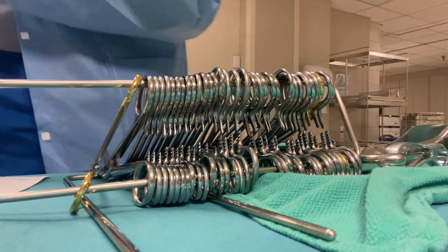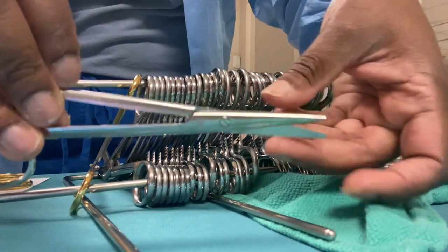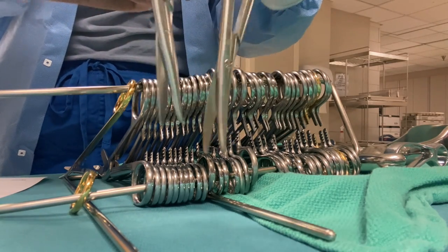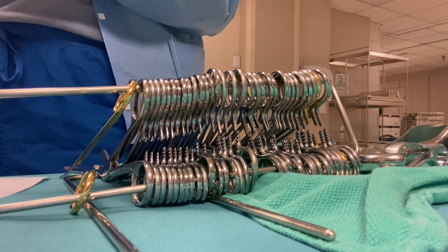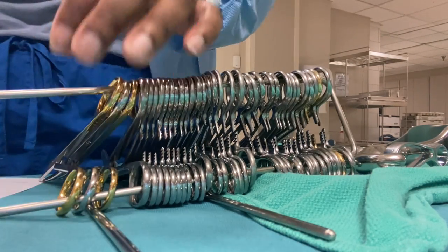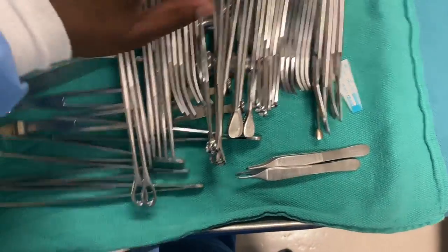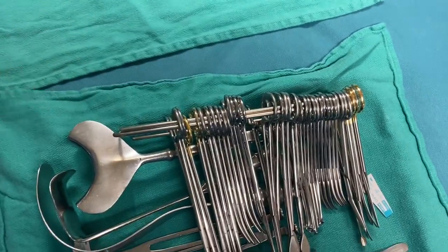Okay, so next is curve mayos. And I'm gonna put them beside the straight mayos. And that's the last of the straight mayos. So y'all, this is my finished product. And I'm gonna place that towel on top of here. Now it's time to wrap.